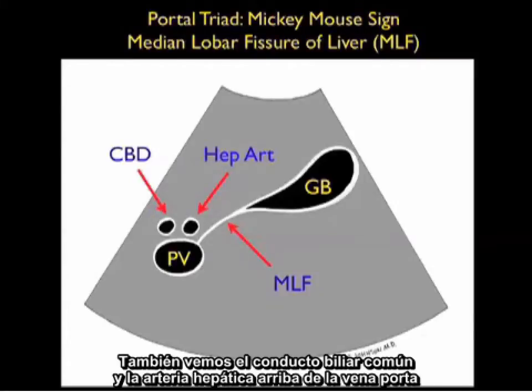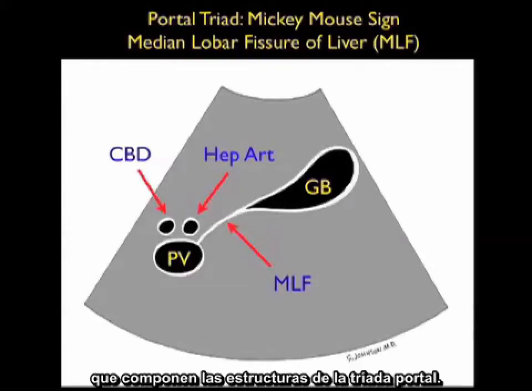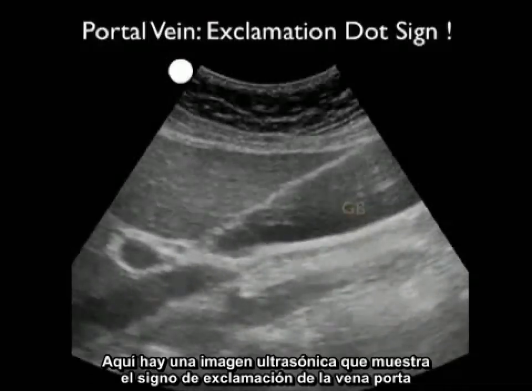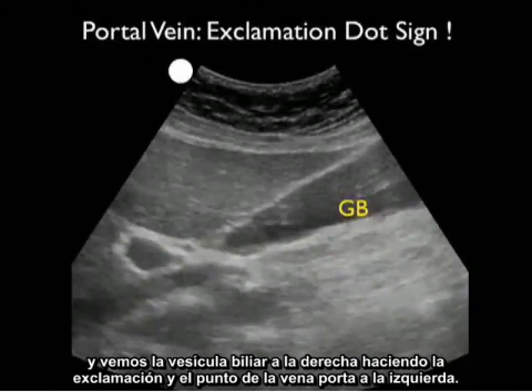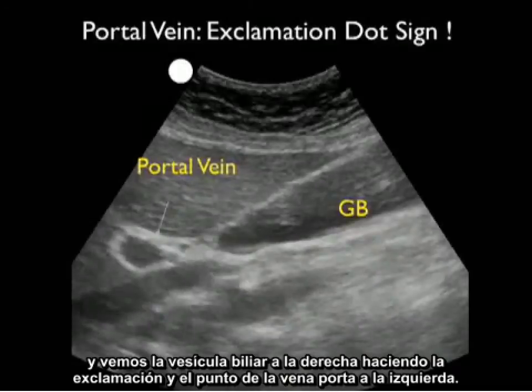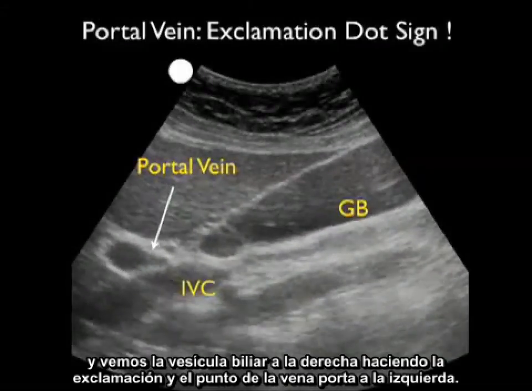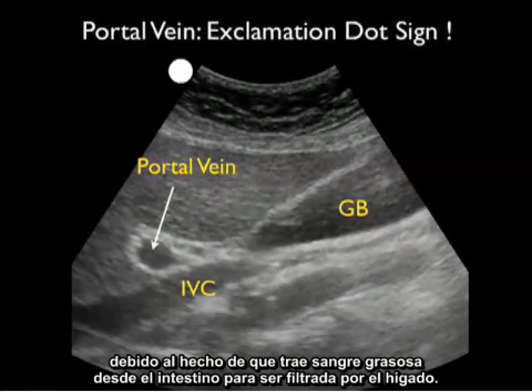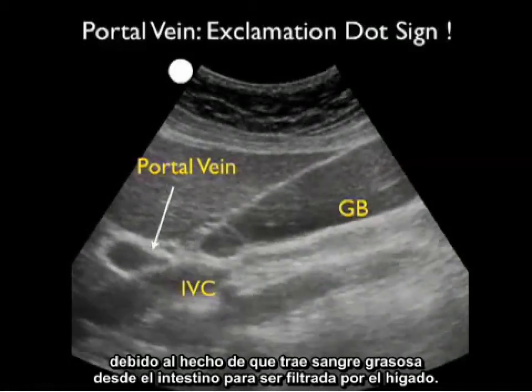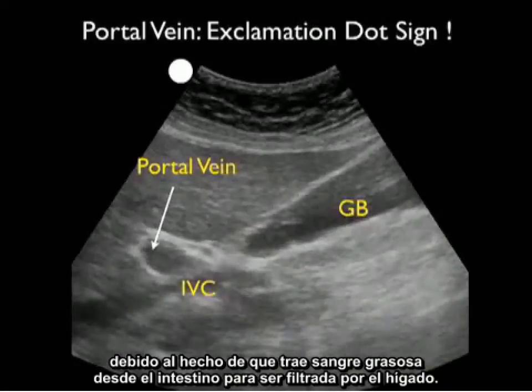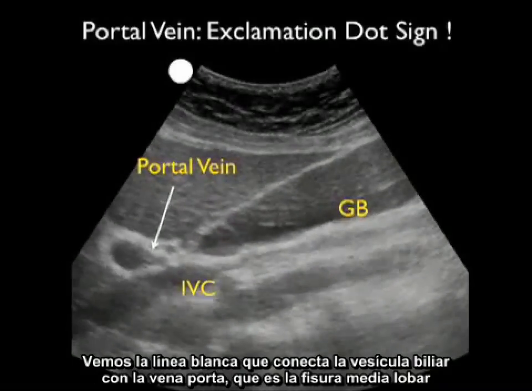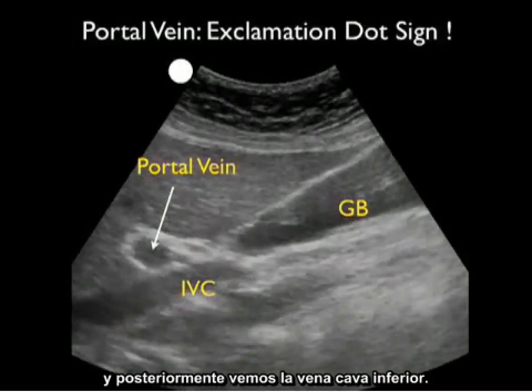We also see the common bile duct and hepatic artery on top of the portal vein, making up the structures of the portal triad. Here's an ultrasound image showing the portal vein exclamation dot sign — the gallbladder to the right making the exclamation, and the portal vein to the left as the dot. Notice the portal vein has hyperechoic walls because it brings fatty blood from the intestine to be filtered by the liver. We also see the median lobar fissure connecting the two, and posteriorly the inferior vena cava.